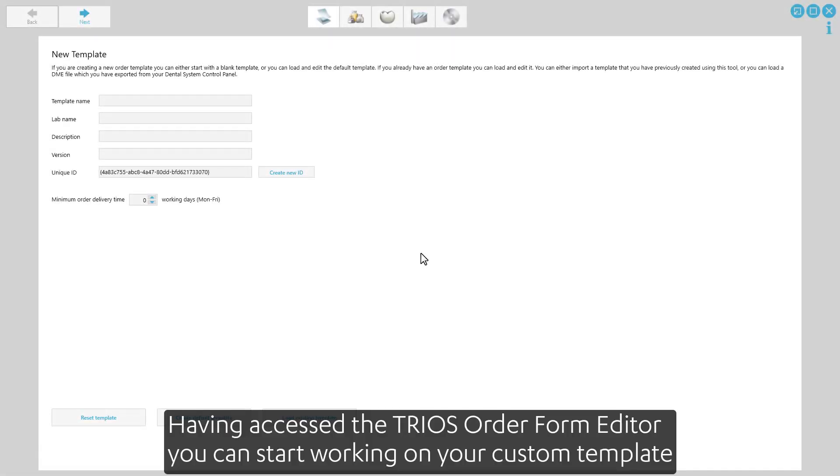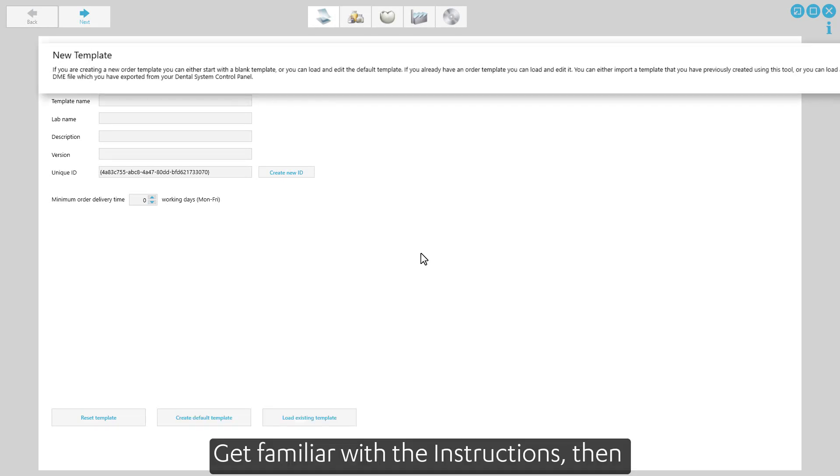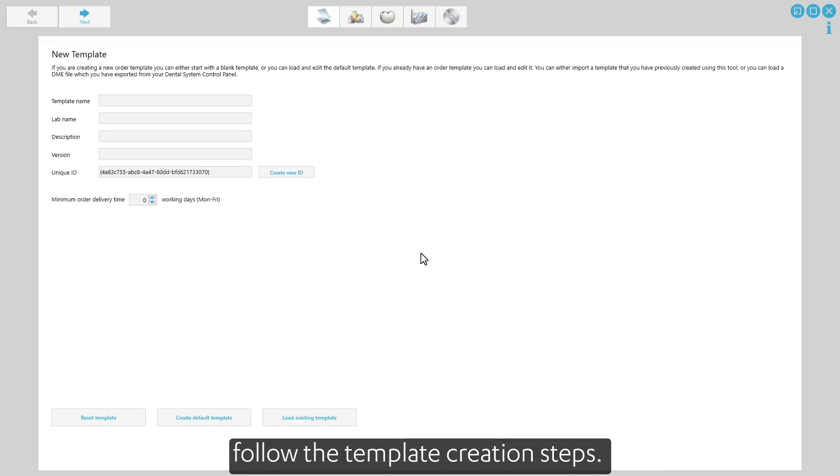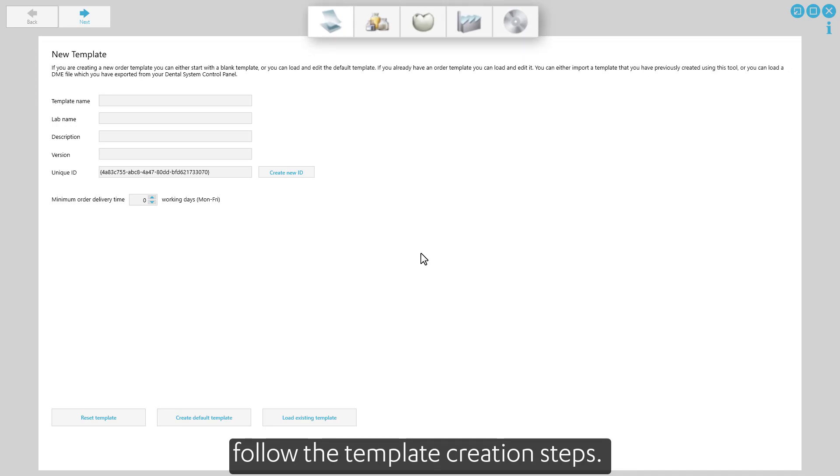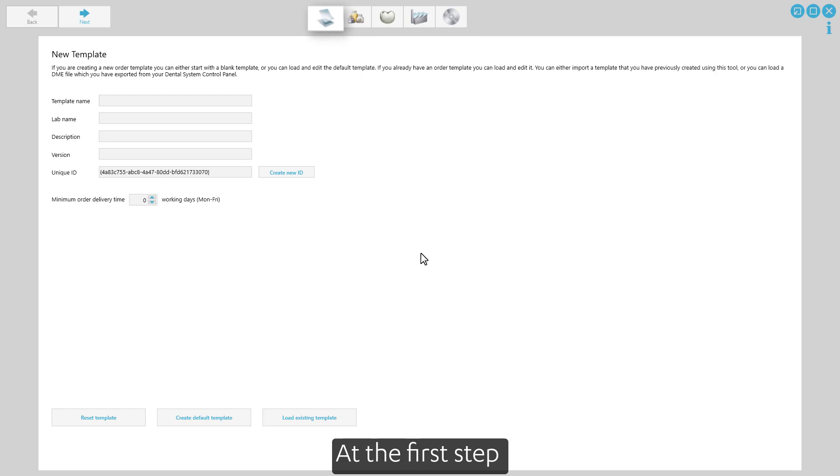Having accessed the TRIOS order form editor, you can start working on your custom template. Get familiar with the instructions, then follow the template creation steps. Each step includes a procedure description.